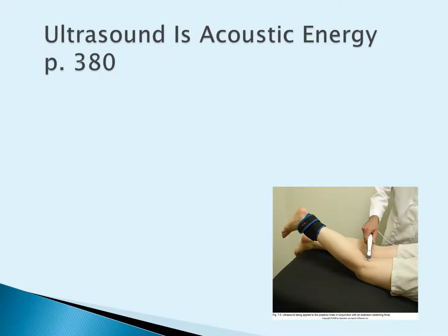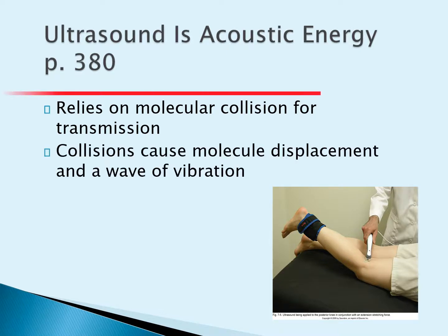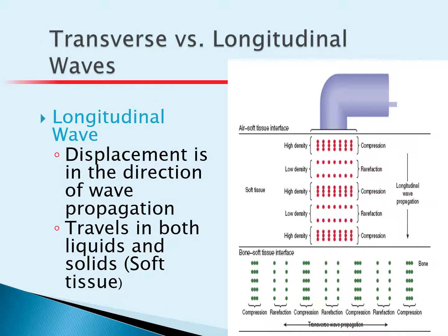Ultrasound is acoustic energy. It's on page 380. It relies on molecular collision for transmission. So basically the sound waves themselves are going to go inside the body and cause the body's own cells to kind of bang off each other to create molecular displacement and create a vibration.